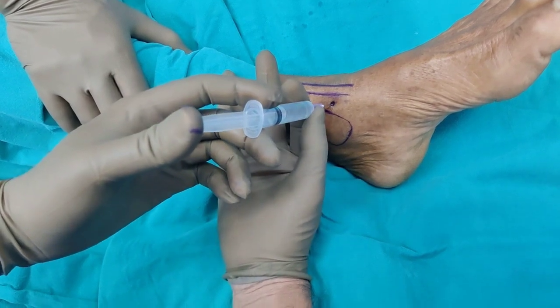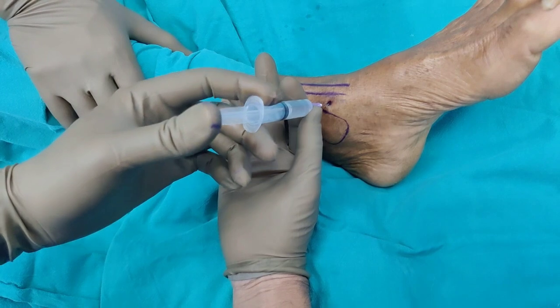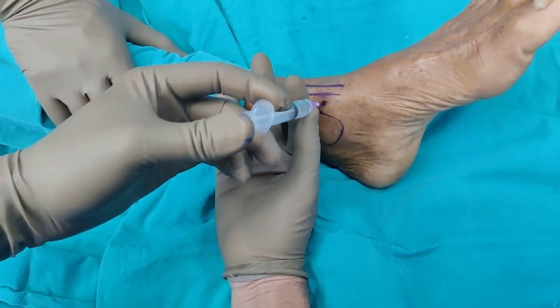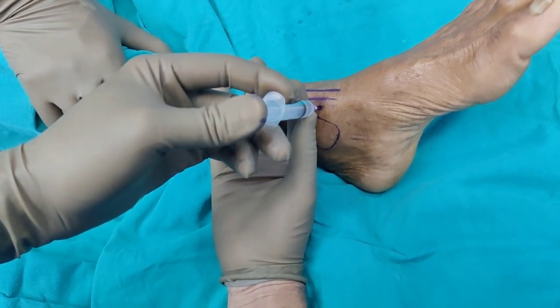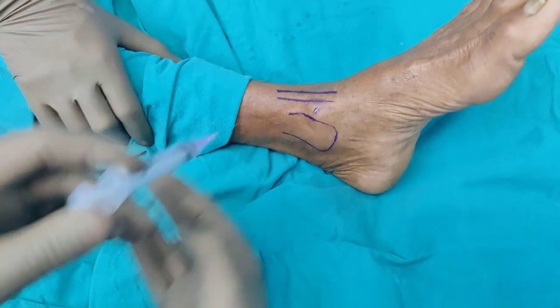The first step is to inject some local anesthetic — go slowly and take it as deep as possible so that you infiltrate this area and make it as pain-free as possible for the patient. Just inject and then wait for a few minutes.